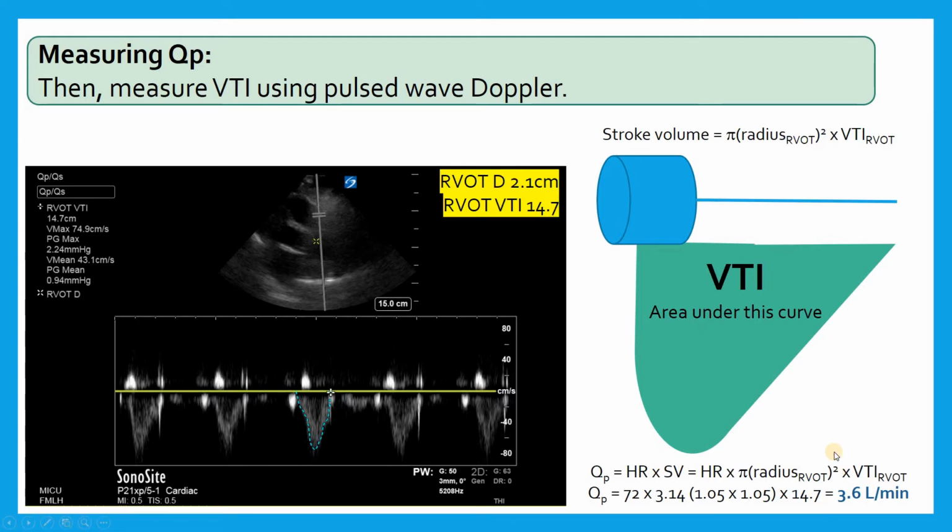I'm not a congenital cardiologist. I'm not sure if I could understand QP, QS otherwise, but it's something worth potentially doing in some patients that may have shunt, particularly if there was some concern that there was increased circulation through the pulmonary circuit relative to the systemic circuit or vice versa.